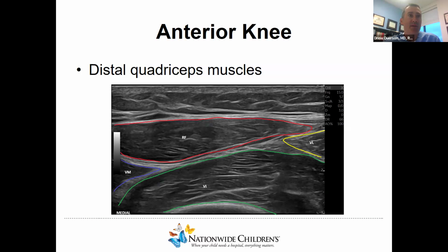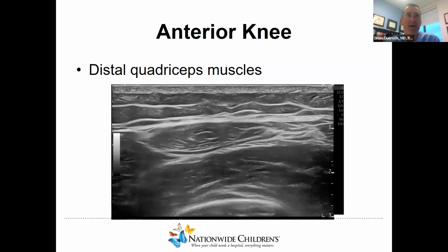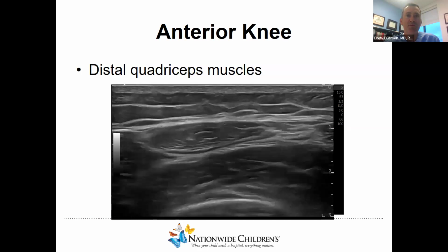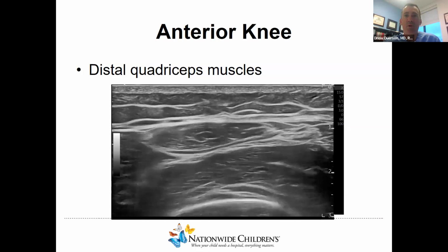And we can see that the rectus femoris and the vastus intermedius don't sit in the same imaging plane. So if one is bright, the other one won't be, and vice versa, as you're getting those nice reflections from the intramuscular connective tissue on one, but not the other. So this video will kind of demonstrate that as I toggle my transducer back and forth. And you don't want to mistake that cloudy appearance for edema, because that will often resolve with toggling your transducer. So I think that's one of the little key tips and tricks this morning.